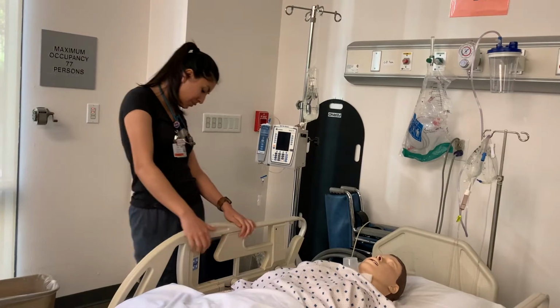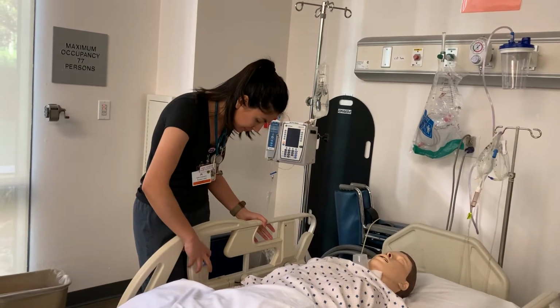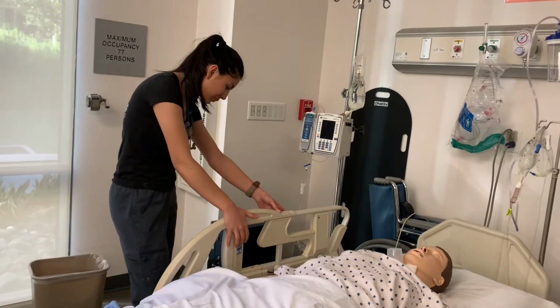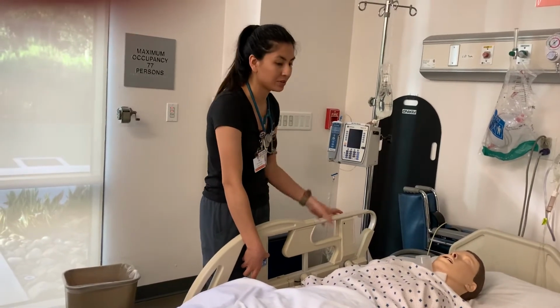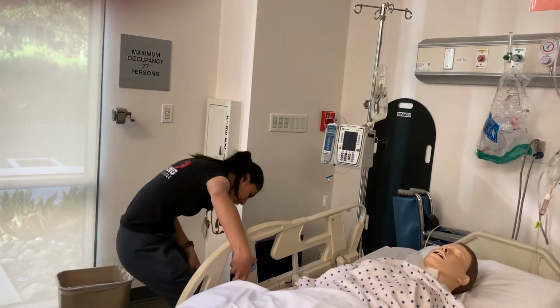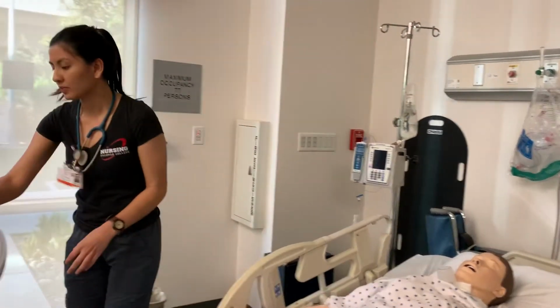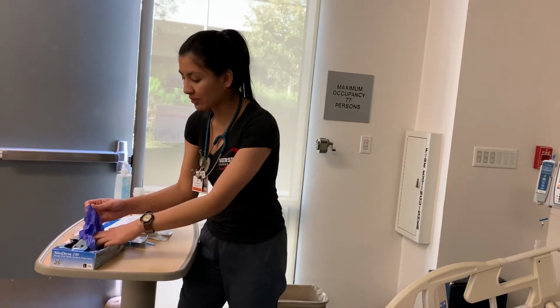Can you tell me if you're having any pain or if you're having any shortness of breath, chest pain, anything like that? I'm not having any pain. Okay. So I'm just going to sit you up a little bit, okay? So I'm going to put the bed in Semi-Fowler's position. Okay. So I'm just going to get clean gloves. I'm going to provide for privacy.